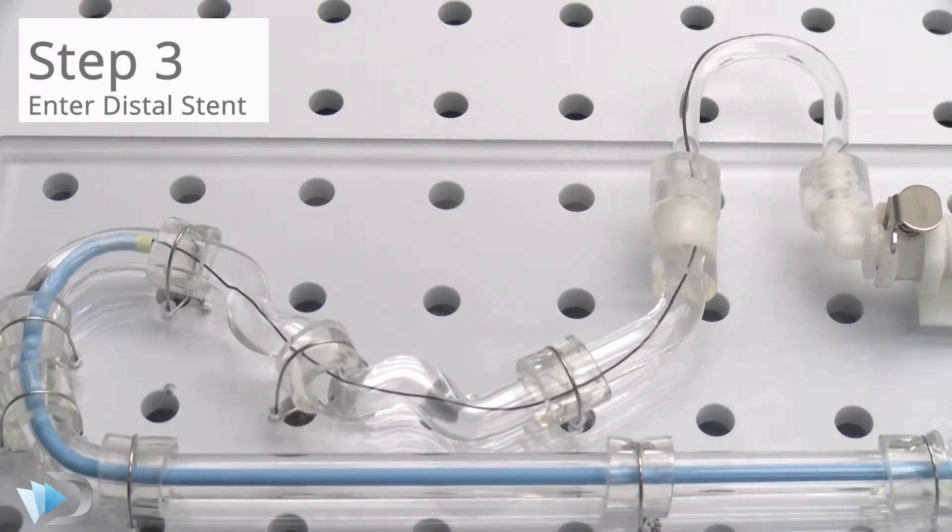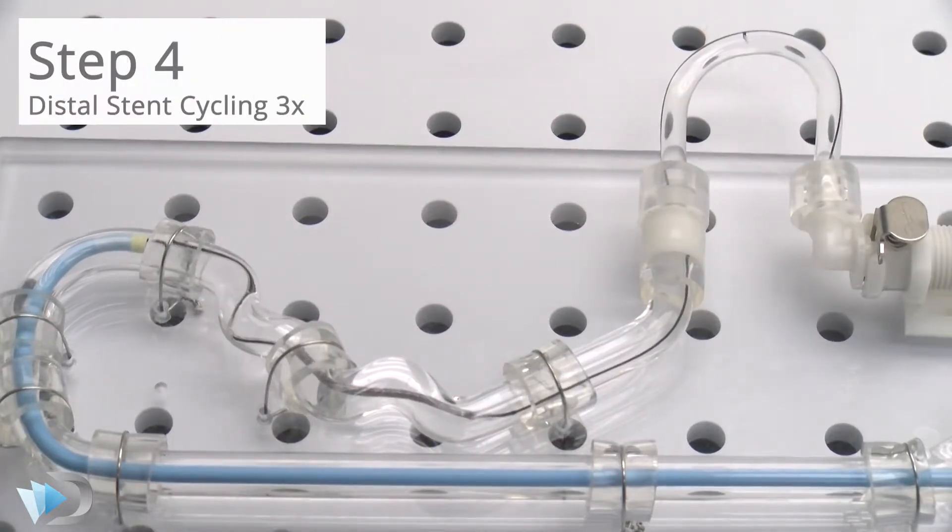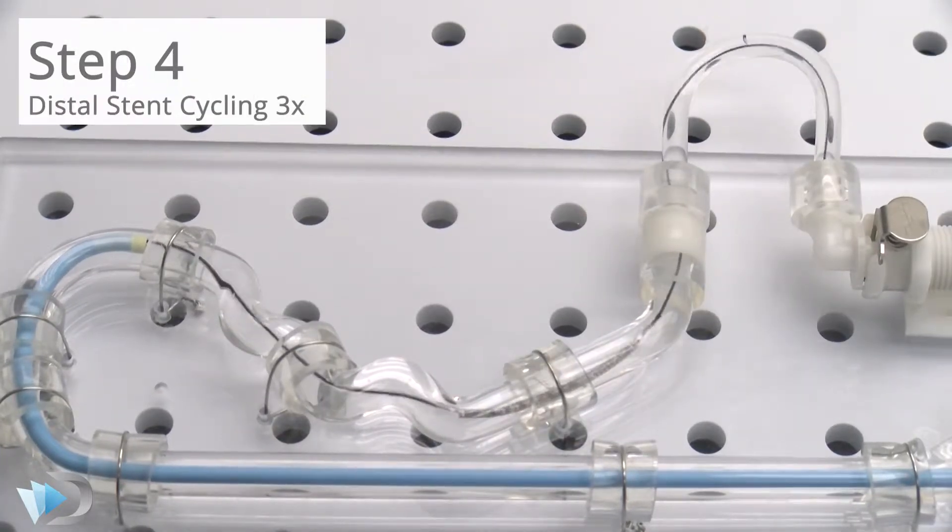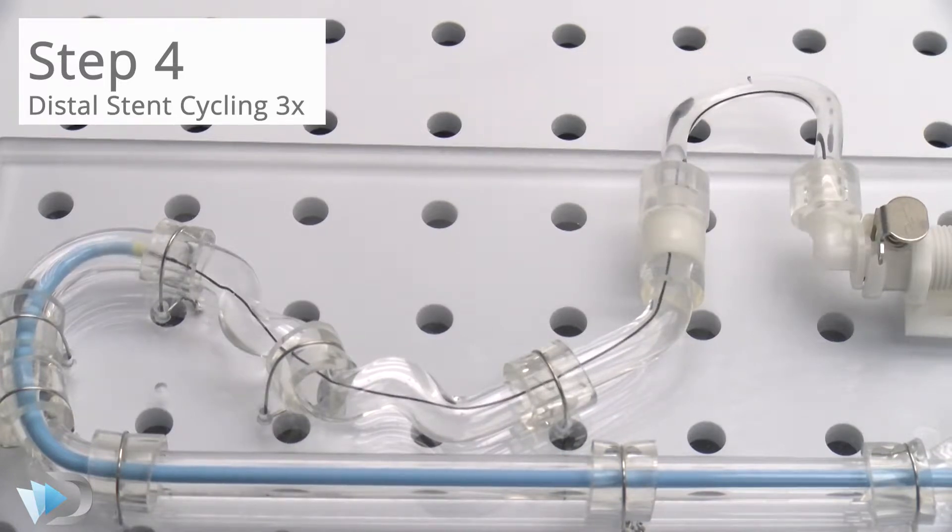Next, the distal stent is inserted to the end of the guide catheter. The stent is tracked through a tortuous path three times and then advanced to the distal portion of a curved mock vessel.